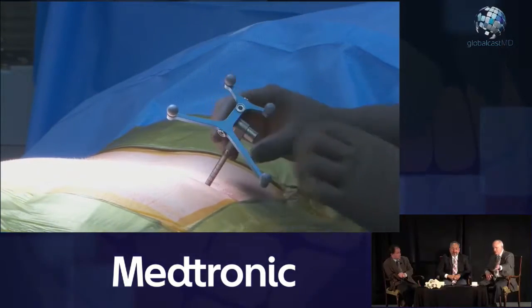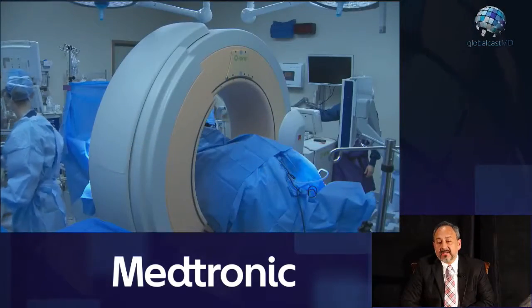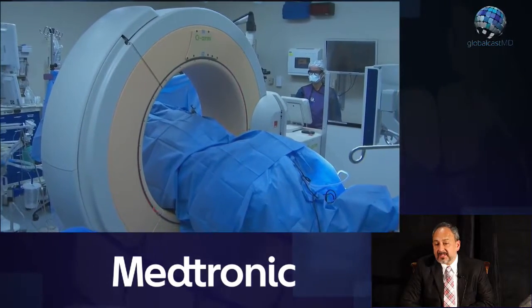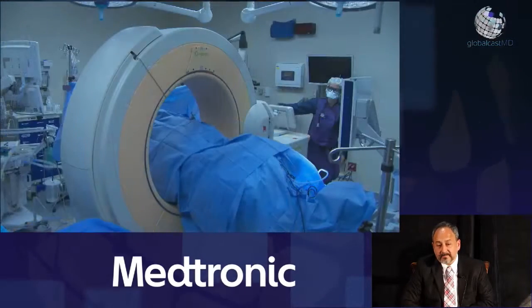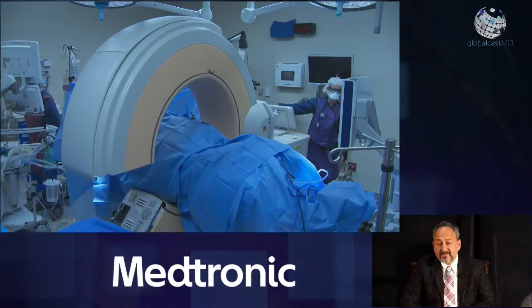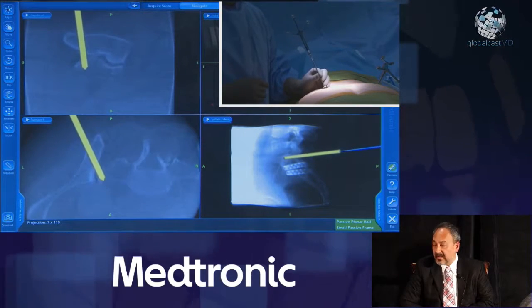The CT scanner, also known as the O-arm, actually comes into the operating room and encases — you'll see a picture of it in just a second. I also want you to notice that I'm placing the pin out laterally so that if I had decided to do a bilateral approach to the SI joint, that's something we could have done very easily. The whole process of CT scanning and loading it into the computer — the Stealth system — takes about a couple of minutes; we actually leave the room and are called back in.